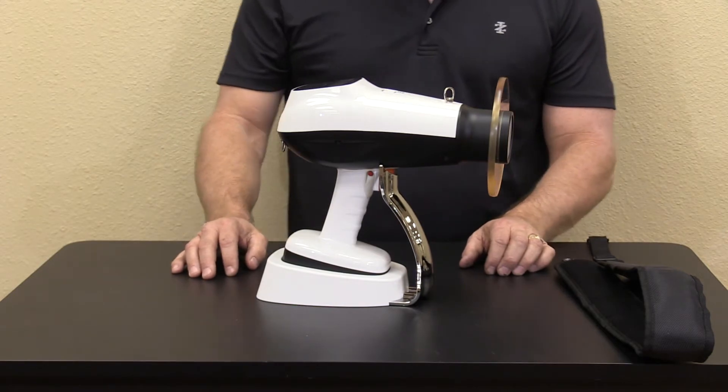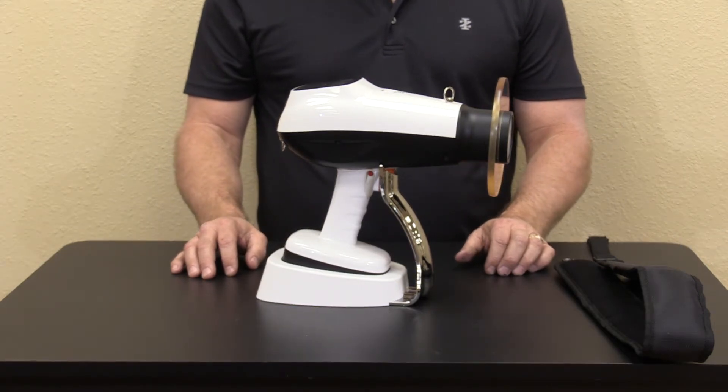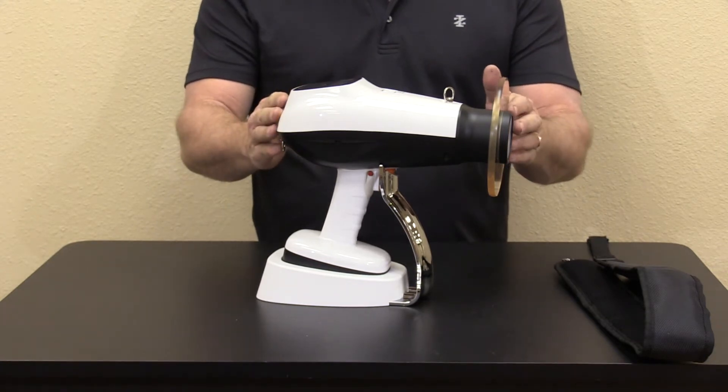Hello, today we're here to do a quick overview on the new MaxRay Cocoon Solo unit with fully computerized exposure.